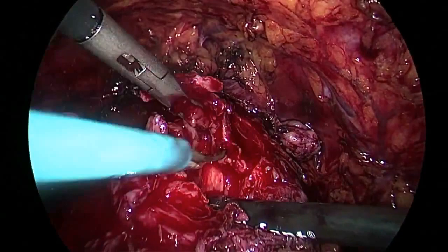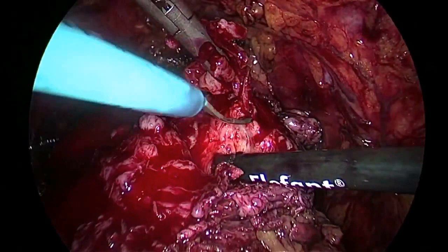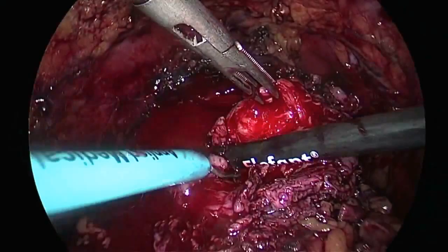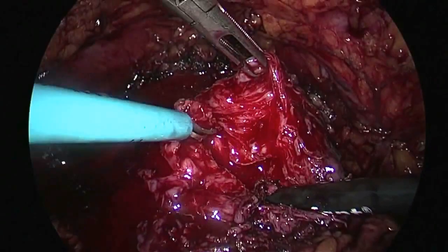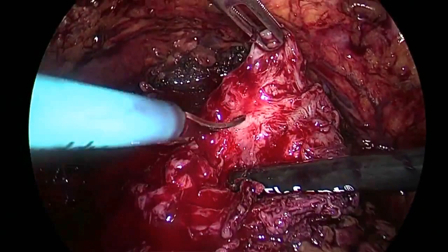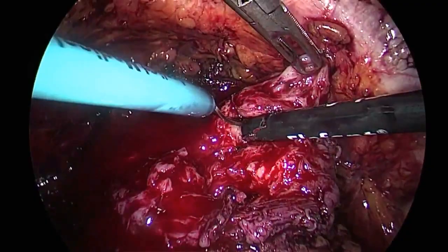You can see now. I remove a little bit of bladder neck because it's important for the trigonization, obviously. You can see now the meatus. The meatus is not important to look at because usually they are behind. Voilà. Coagulation, please. This is adenoma.